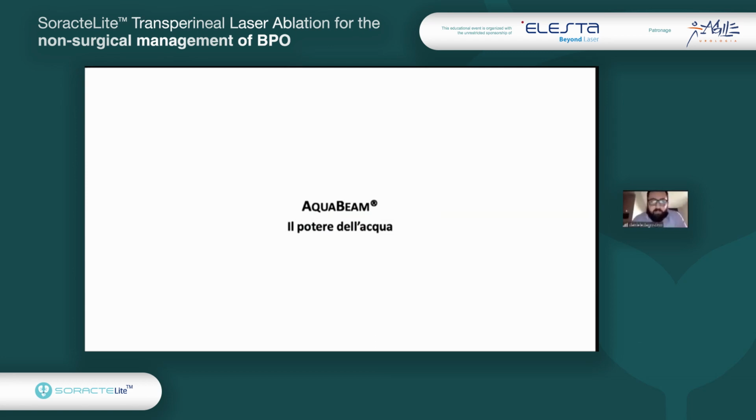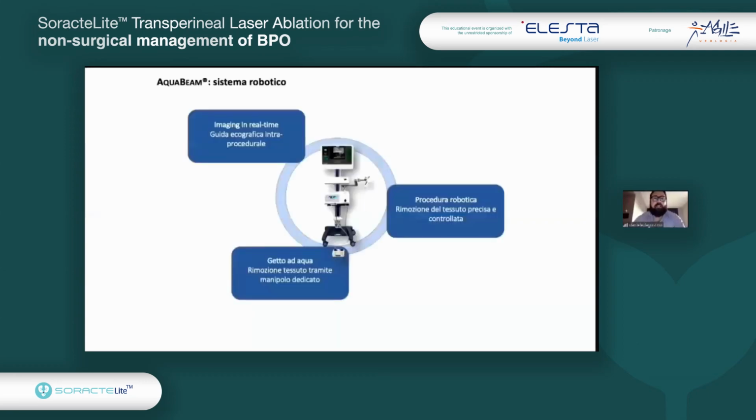I will speak about Aquabeam, about prostatic ablation through the water jet. So the Aquabeam is a robotic system, a robotic approach for treatment of BPH, and the Aquabeam is the combination of three important aspects.